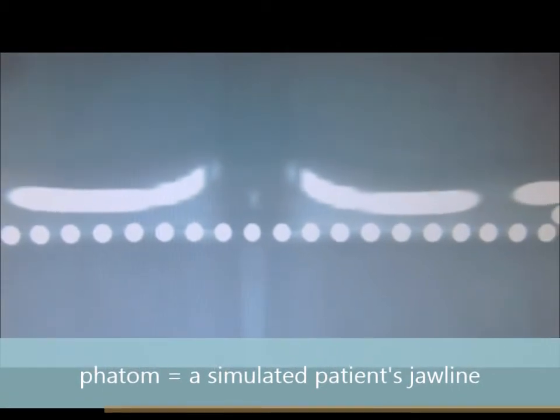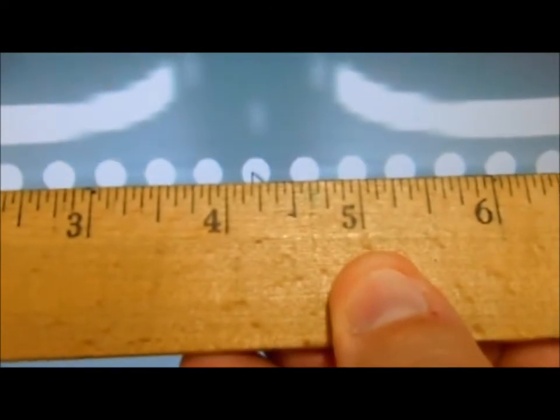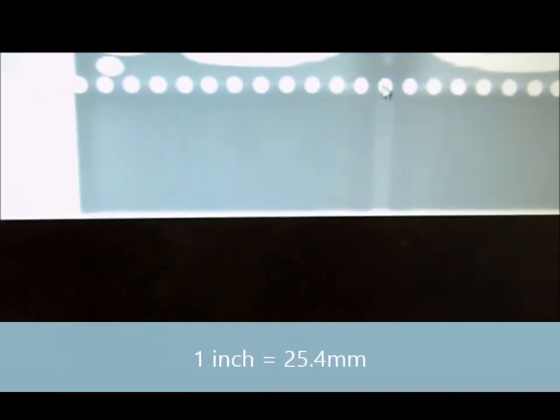Here is a sample image of the ball phantom, starting from here all the way down to here. We should have 23 symmetrical round balls. We will measure the first ball to the middle 10th ball using our ruler in inches — it's about 4 and a half inches. To convert that, 1 inch equals 25.4 millimeters, so that's about 114.3 millimeters.